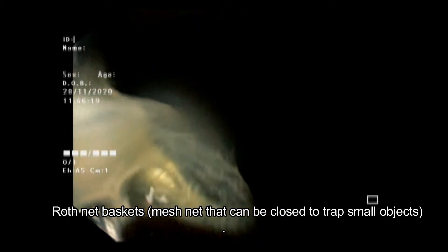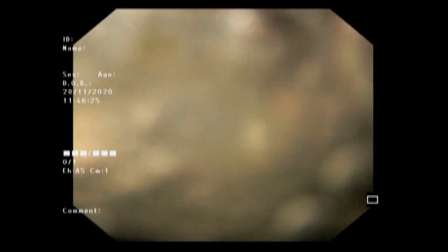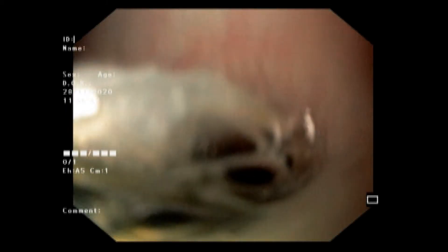During removal of the coin we encountered two constricted areas in the upper GI tract: one is the gastroesophageal junction and the other is the cricopharyngeal constriction. We passed the gastroesophageal junction with mild resistance, but then felt resistance at the cricopharyngeal constriction.